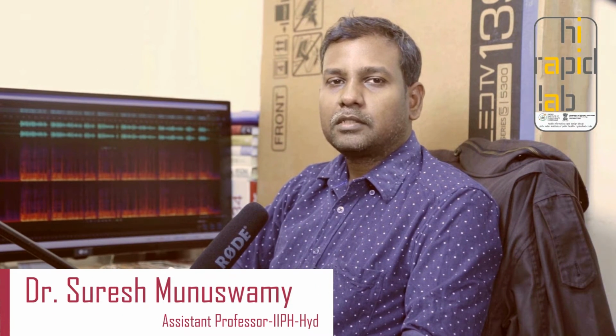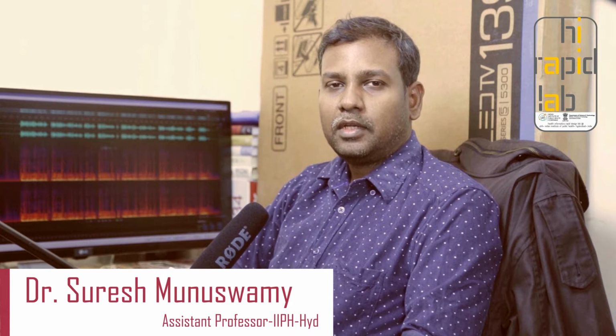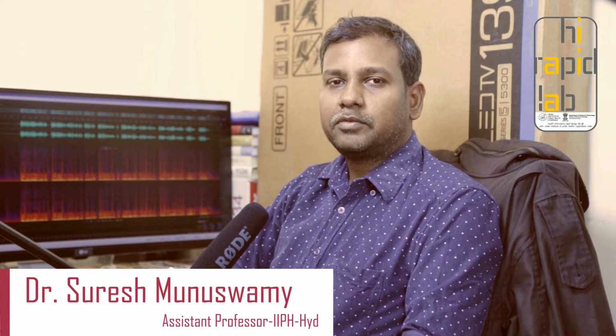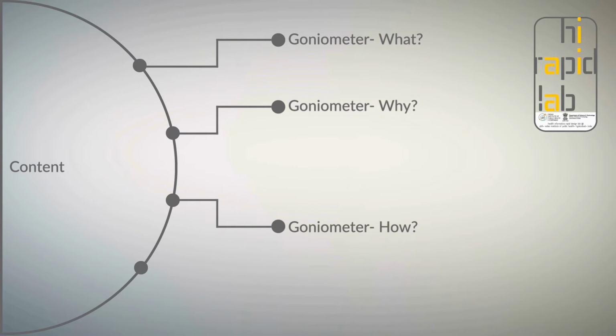Hi, welcome to video episode number 1 of Project Does Simple, in short for Disability Assessment and Support Made Simple. This is a video series in which we will talk about several aspects of digital disability assessment and digital direct benefit linkage. In this video episode, we will talk about: 1. What is a goniometer? Why do you need a goniometer? How do you use a goniometer? And finally, what are the types of goniometry? And I am Dr. Suresh, your presenter for this video.